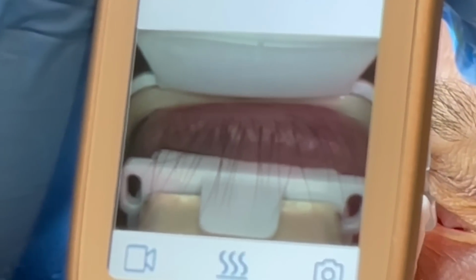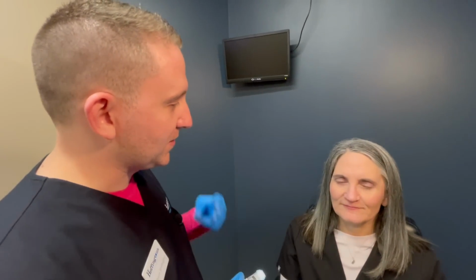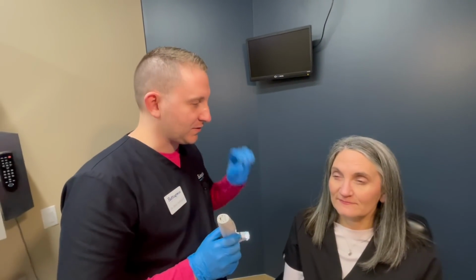One more little push. Good. That's what it takes to do one eyelid. We just do that 3 more times, and that completes the entire procedure. How do you feel so far? Good. Nice and relaxing. We like nice and warm. We like warm, nice, relaxing, melting all that hardened oil to get it to the surface.